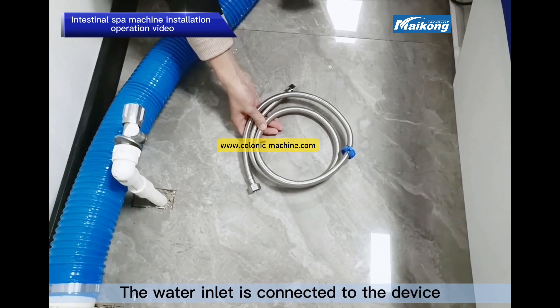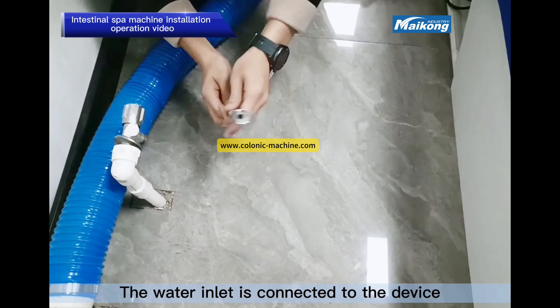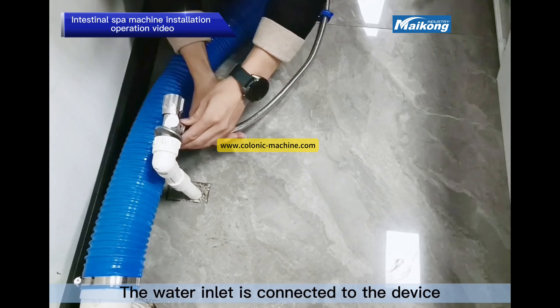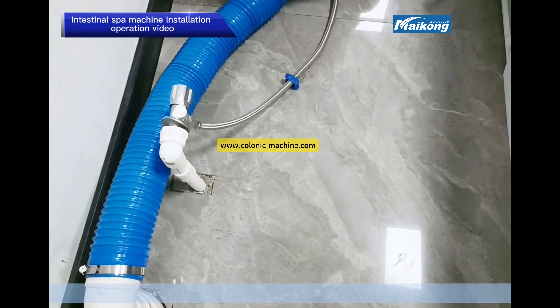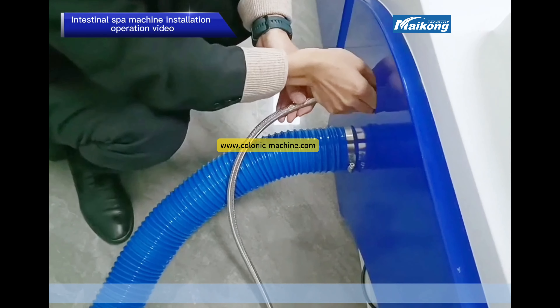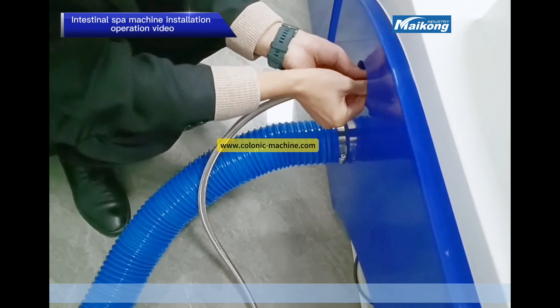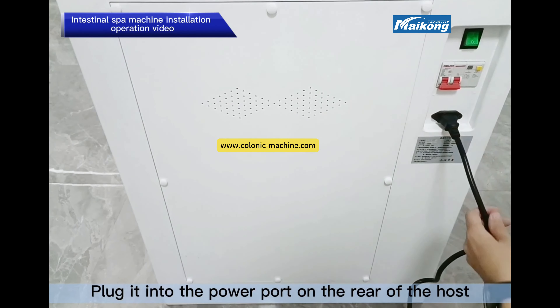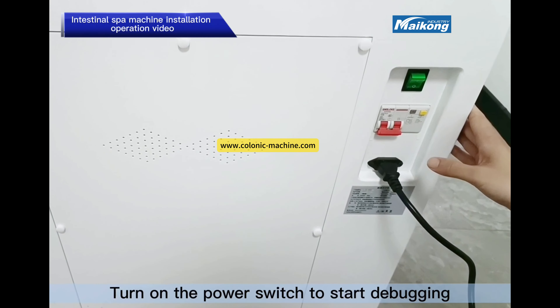The water inlet is connected to the device. Finally, take out the power cord and plug it into the power cord port on the rear of the host. Then access the room power supply and turn on the power switch to start debugging.